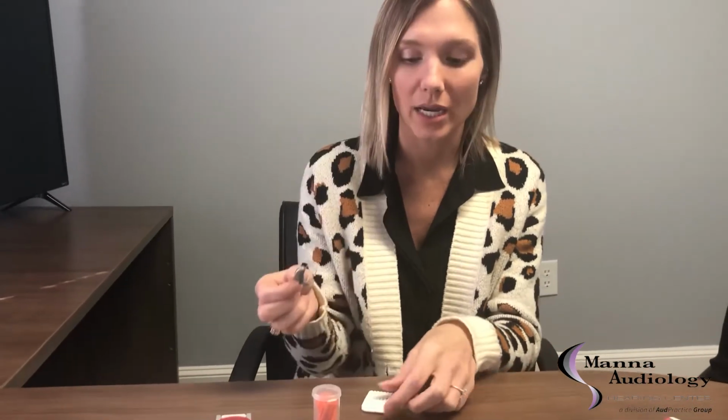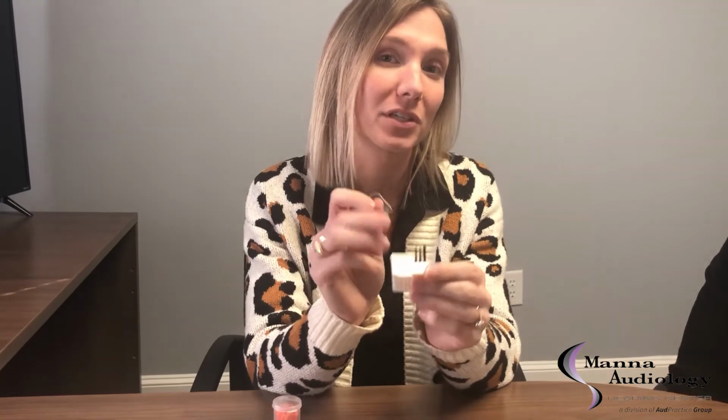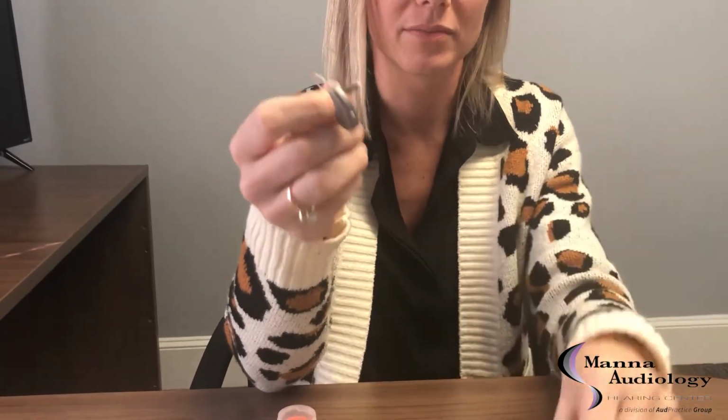Okay, so the next one is a Widex hearing aid. Very similar to the Resound, so the sticks look very similar. They are not interchangeable, however. So if you have sticks, not sure which ones are compatible with your hearing aid, or maybe you're searching online for something similar, be careful because they may look similar, but they might not fit your actual hearing aid. So again, the dome pulls right off.